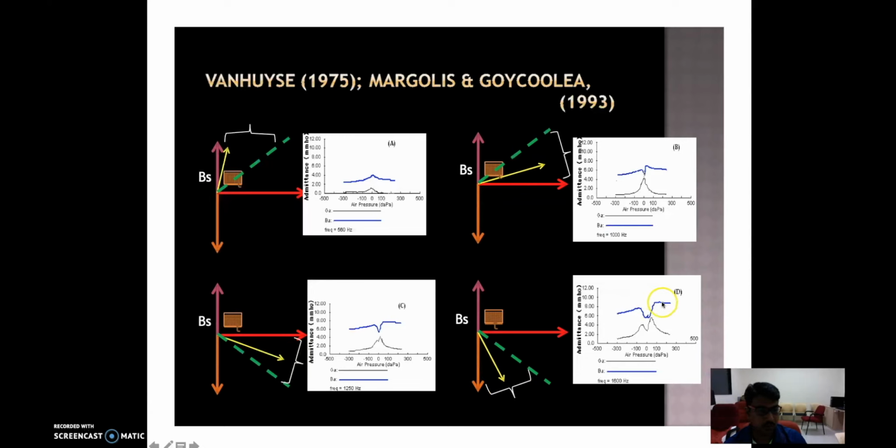then what you get is a pretty complex notching for the B graph. That is, you have 1, 2, 3, 4, 5. So that is 5B 3G. Whenever you get a 5B 3G pattern, it indicates that the impedance vector is flowing very close to the mass axis. Okay.